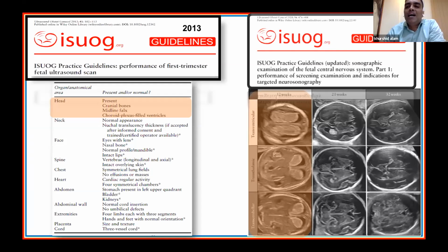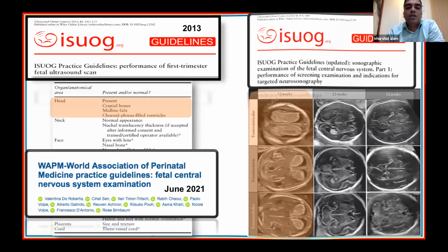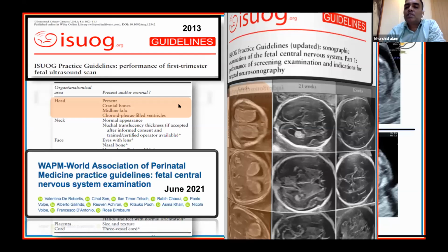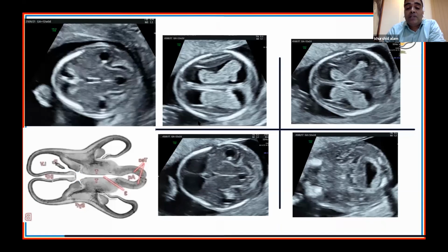Yes, sir, exactly that. And in 2020, they have just included 2 more planes, a transthalamic and a transcerebellar plane. And this is the latest, which has come in June 2021. It's a freely available paper, so one can go through it and form their own checklist, but we have to keep it minimum basic so that we all can do that, and which is very practical. So again to you, Pushan Kundu sir, can you explain the sections, like when we are examining the fetal brain, at least 4 sections we have to take to cover our checklist. Can you explain them, sir?